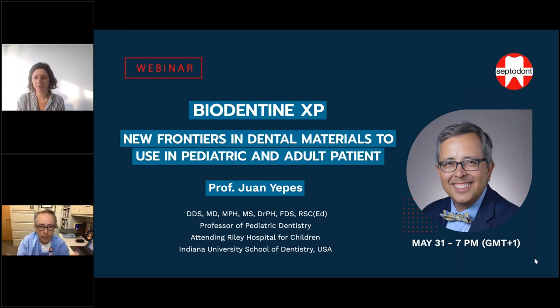But I will stop here, and I will just close the answer to your question, Aurelie. Yes, Biodentine can be used in pulpotomies. It doesn't matter if it's an adult or a baby tooth, you can do it. But it is critical, as you probably know as well as me, to have the correct diagnosis before we use Biodentine. Like everything in dentistry, we need to have a diagnosis before we move into the next step.